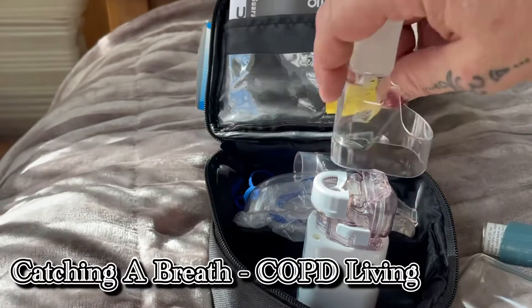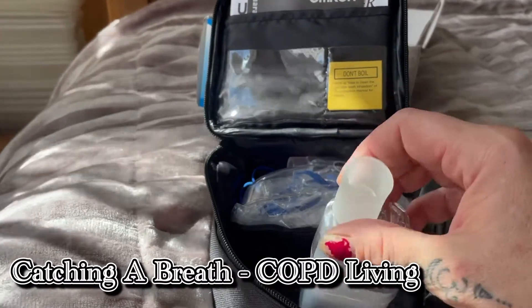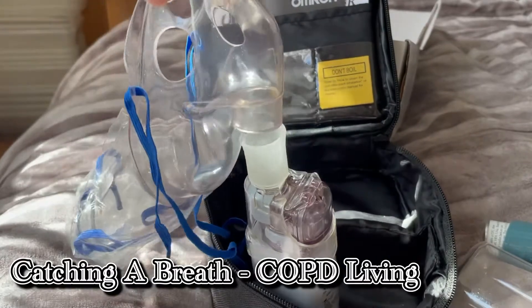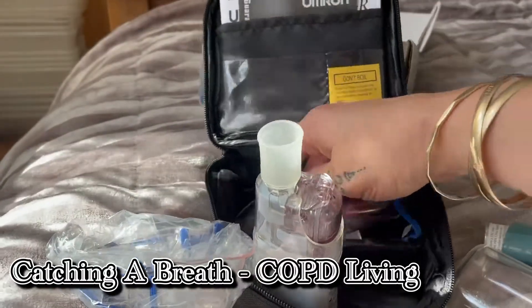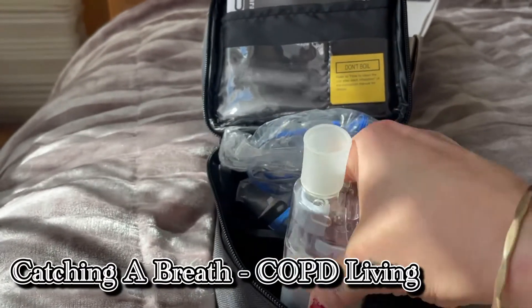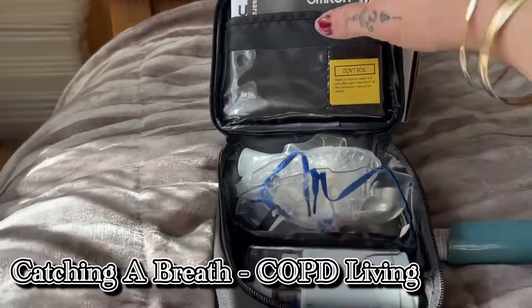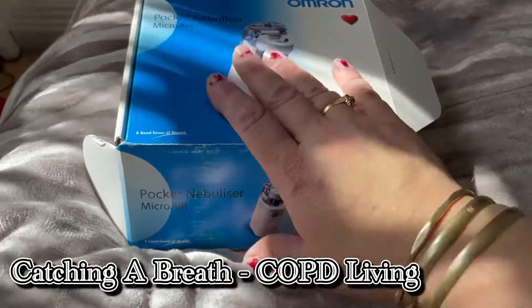It comes with this bit here which you can put on so you're breathing it through there. Or if you take that rubber bit off, it comes with a mask — a child mask and an adult mask. It's a wonderful gadget. This one's virtually brand new, so I'm going to pack it up and get it straight in the post. Right, that's going to be flying on its way to you mate, and I'll see you guys in a sec and I'll show you about my one.